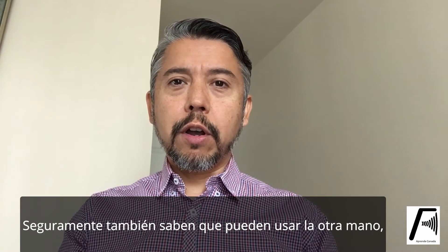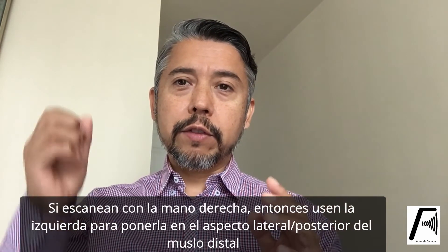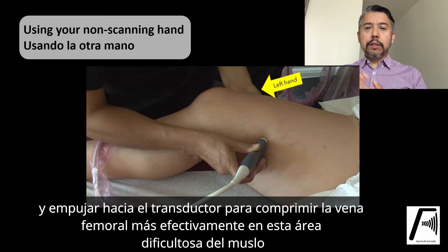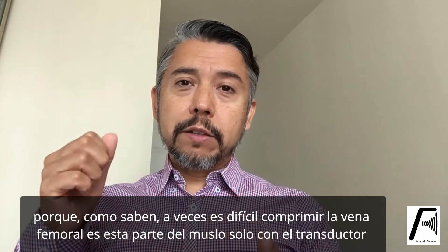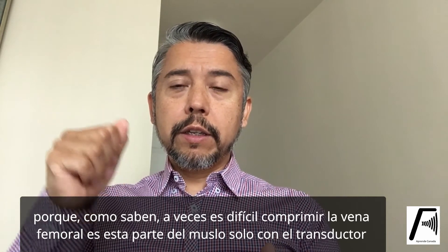You've probably also heard of trying to use your non-scanning hand — so if you're scanning with your right hand, using your left hand placed underneath the distal thigh to push up, hoping to compress the vein much better at that point. That would be the femoral vein, because sometimes it is very difficult to compress with your probe.